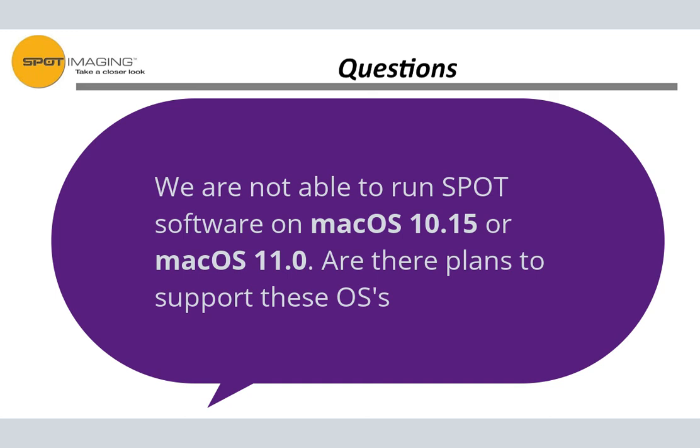Also note that PathSuite is not designed to run on the Mac at all, and there's no plans currently to move to the Mac platform with the PathSuite software. So right now, our solution is basically Spot 5.6 on Windows 10, running under Parallels on the Mac system.